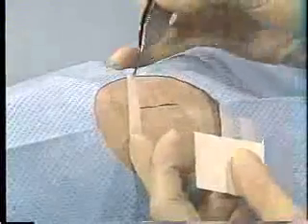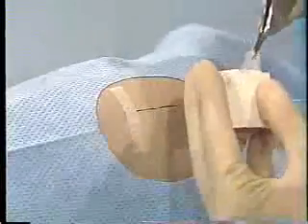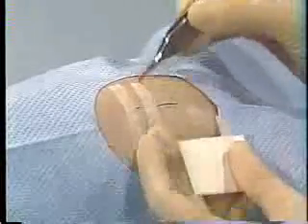Use a pickup to handle the tape to avoid getting blood and powder from your gloves on the tape. Pull the skin edges together as you secure the tape. Dress the wound with a small dressing and tape.